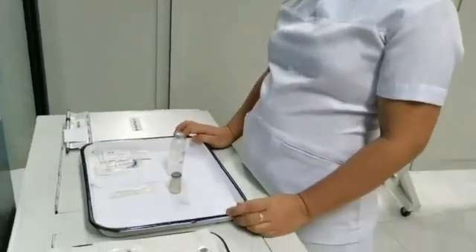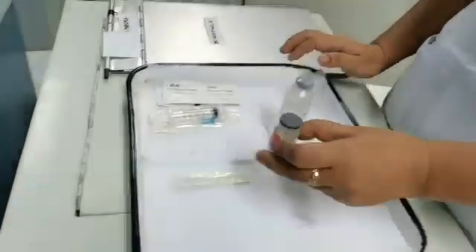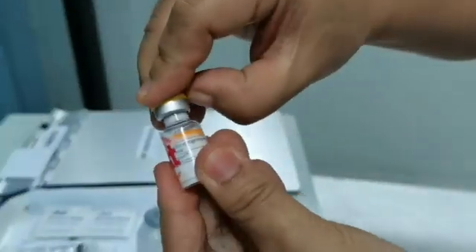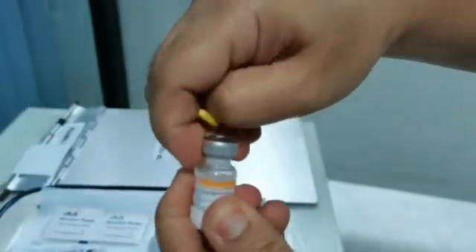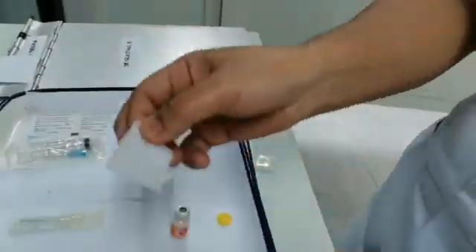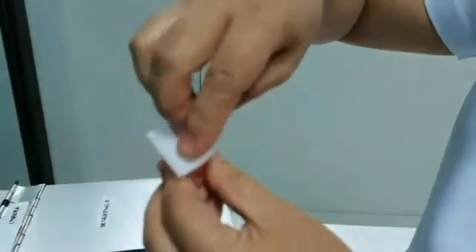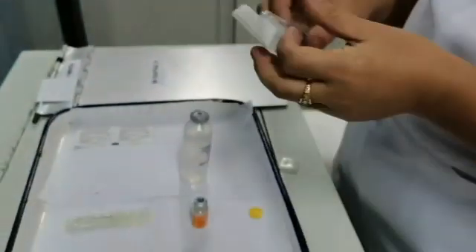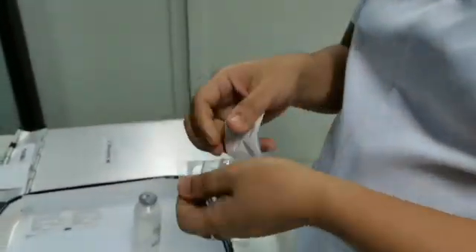Remove thin seal cap from top of vial without touching the rubber stopper. Firmly wipe rubber stopper on top of vial with alcohol swab. Read the instruction of vial label as to the amount of diluent you are going to use. Dilute or reconstitute the powder drug in the vial.